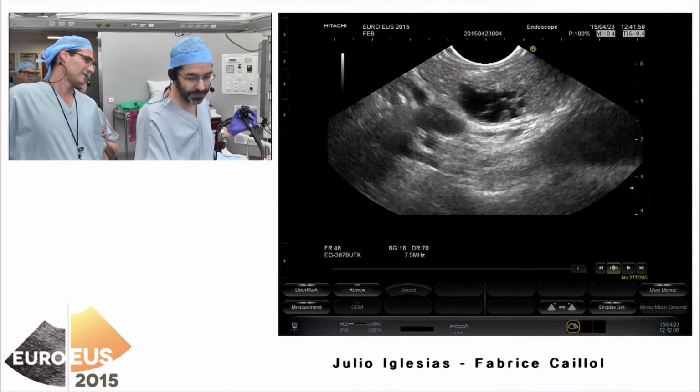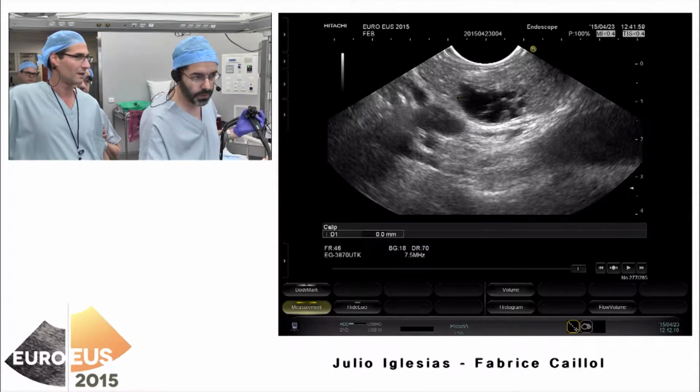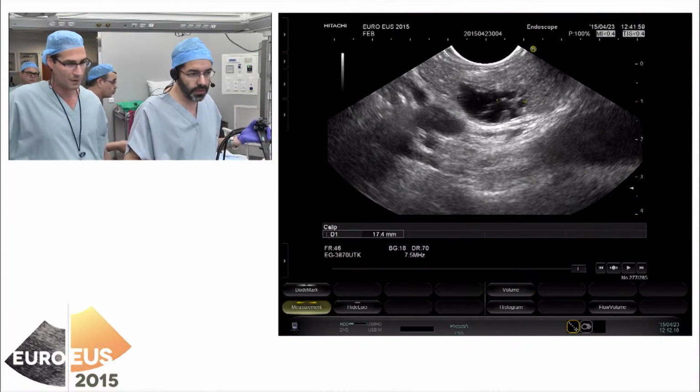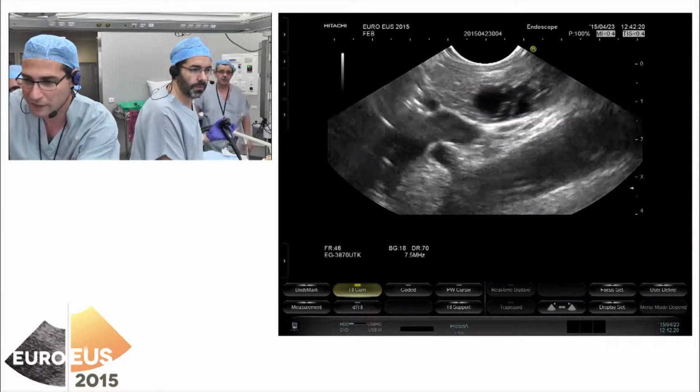That's a good question. Okay, we will measure, and I think yes, the best thing is to try to sample and make the confocal. Yeah. So we will go directly to the confocal. Yes, because we have not a lot of time.